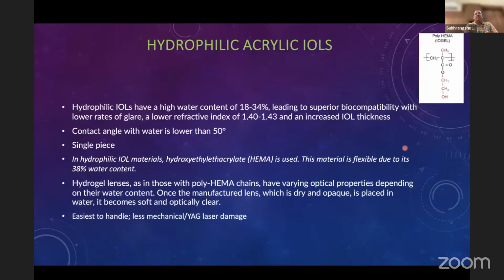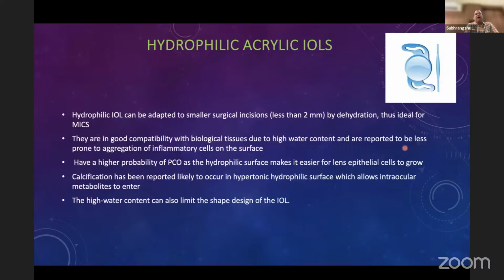So coming to the hydrophilic acrylic IOLs, they have a higher water content, leading to superior biocompatibility with lower rates of glare, a lower refractive index, and an increased IOL thickness. They're usually single-piece IOLs. They are easier to handle, and they are less susceptible to YAG laser damage. Hydrophilic IOLs can be adapted to smaller surgical incisions by dehydration, and thus they are ideal for MICS.